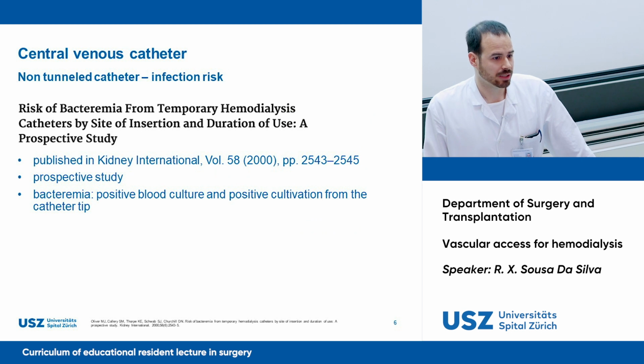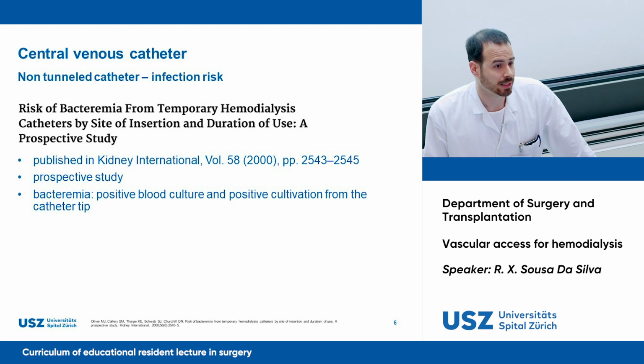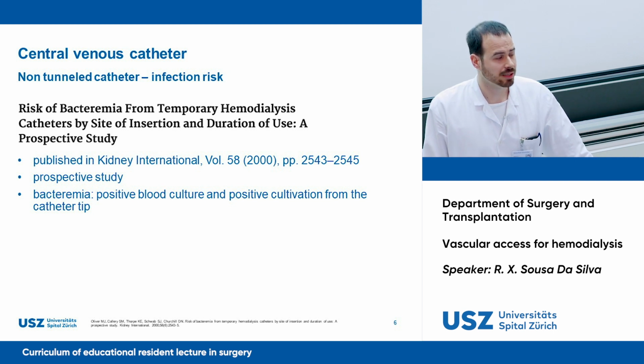Concerning infection risk, Oliver et al. showed in 2000, in a prospective study published in Kidney International called Risk of Bacteremia from Temporary Hemodialysis Catheters by Site of Insertion and Duration, the following results I will present to you.